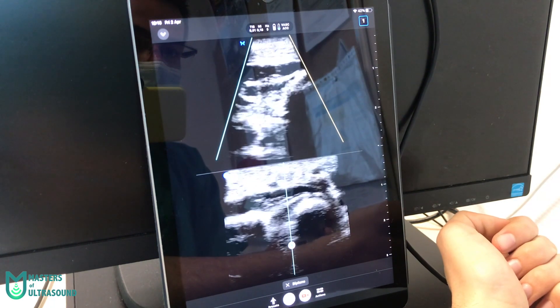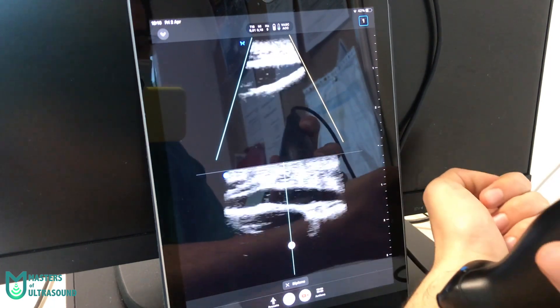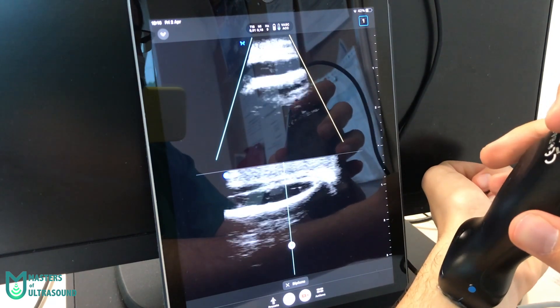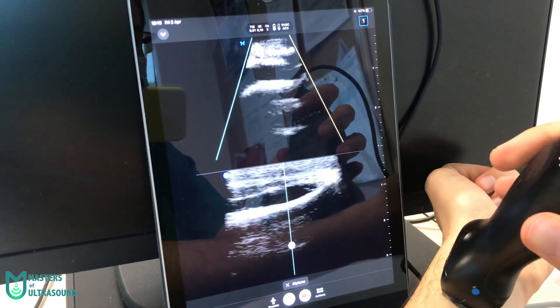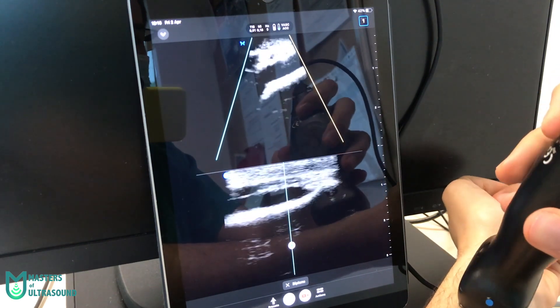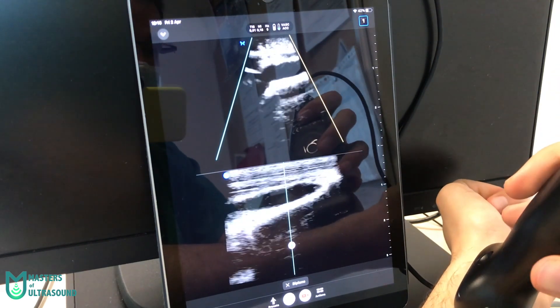It's hard to optimize the image when you're scanning yourself. Here you can see how rotating the Butterfly IQ Plus swaps the images between the longitudinal and transverse axis. Remember, you have to purchase the PRO subscription in order to have this mode.